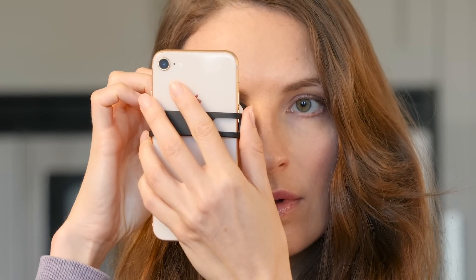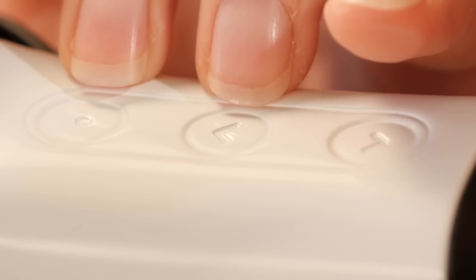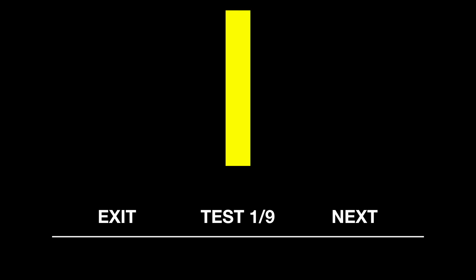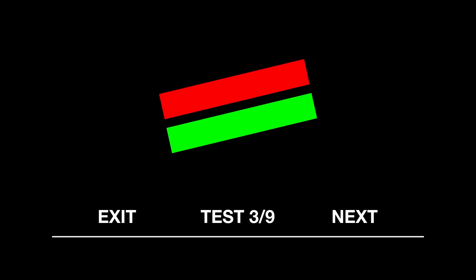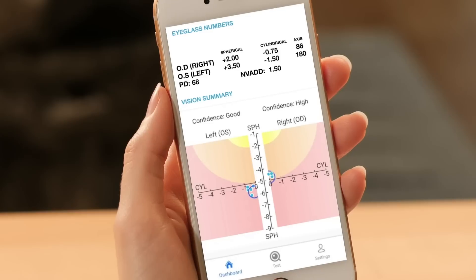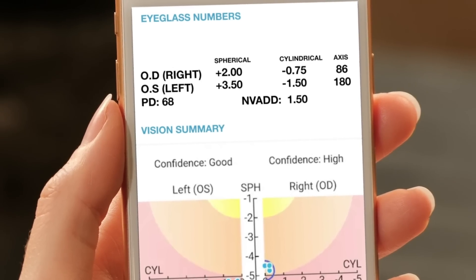While keeping both eyes open, bring the device to your right eye. Using the touch controls on the device, move the lines closer together until they overlap to form a single yellow line. Hit the next button and the precision optical lenses within the device rotate, capturing each meridian of your eye. Once you've completed tests on both eyes, IQ's powerful patented technology will process the readings and generate your eyeglass numbers.